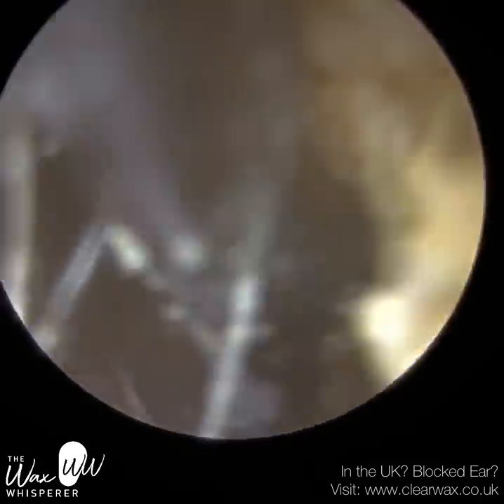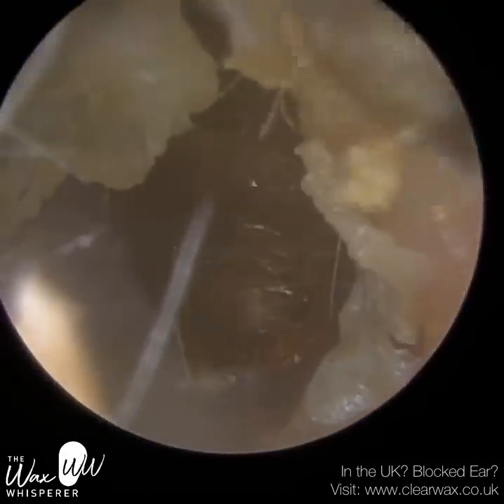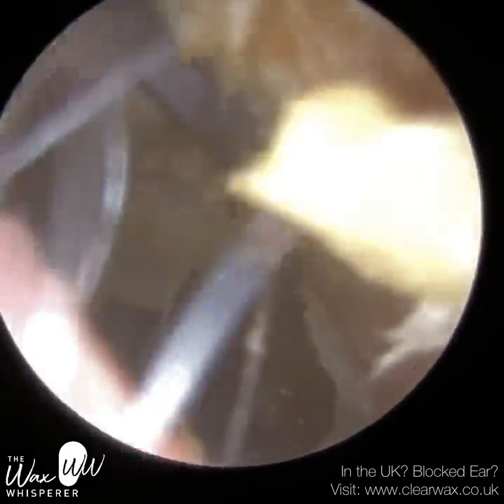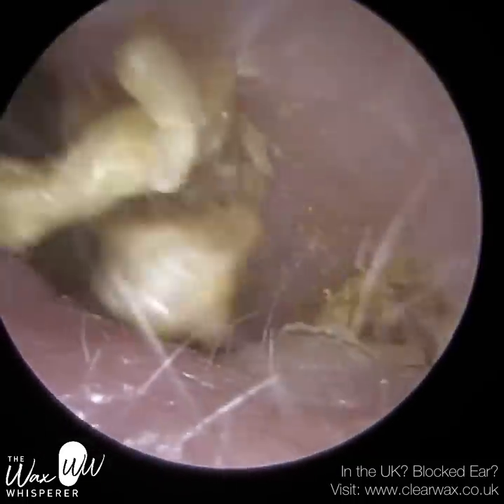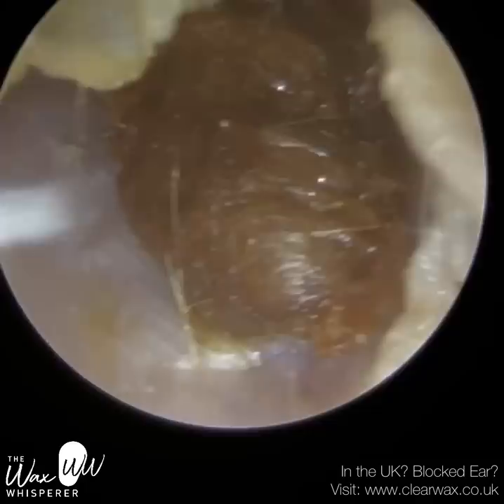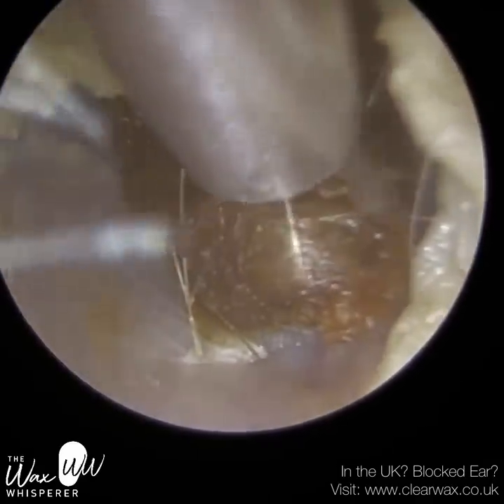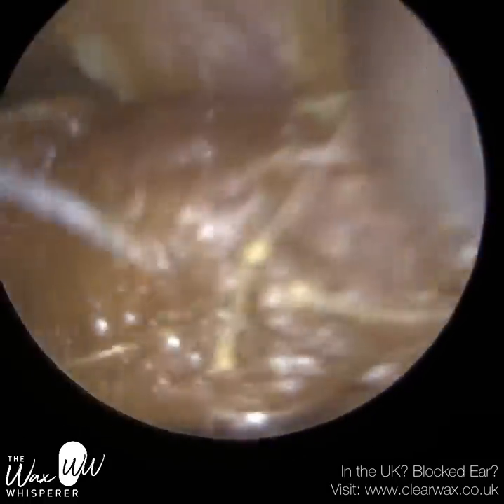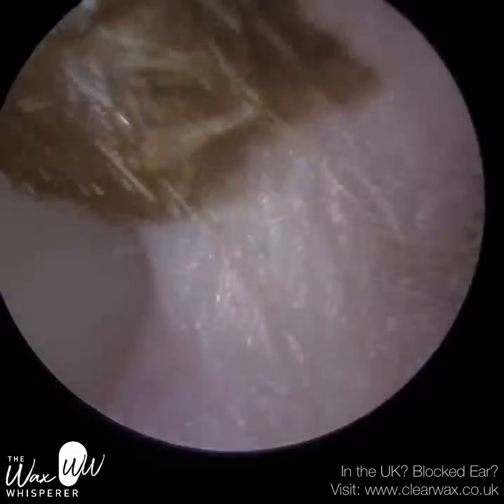I'm holding the iClearScope in my non-dominant hand — that's my left hand — and I'm using the tip of the endoscope. The tip is five centimetres long, and I'm using the distal end to stretch the cartilage to the left. So you can see I'm opening up the ear canal and keeping it ajar. That left hand needs to be really steady — not only to open up the ear canal so I can insert the instrument in my right hand, in this case a sucker, but also to visualise the wax. You can see we're moving large plugs of wax out.